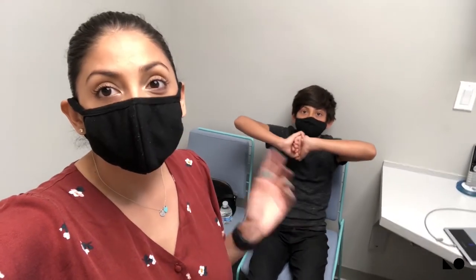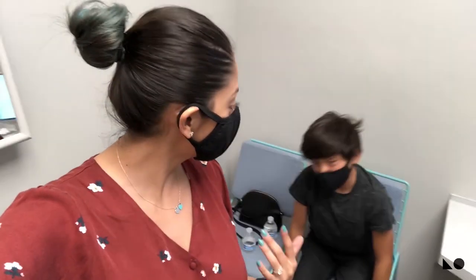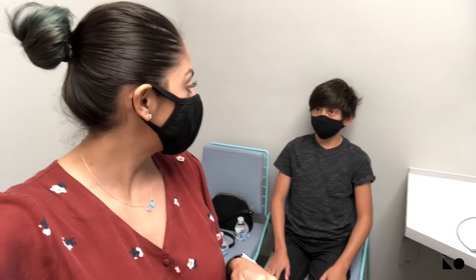We actually heard about CRT lenses from Isaac's dentist, who told us about his daughter doing CRT lenses. Isaac had already been tired of wearing glasses and was interested in getting contacts, but once his dentist brought this up, we were like, 'That sounds way better — you only have to wear them at night.' We started treatment back in April, so it's already been more than a whole year.